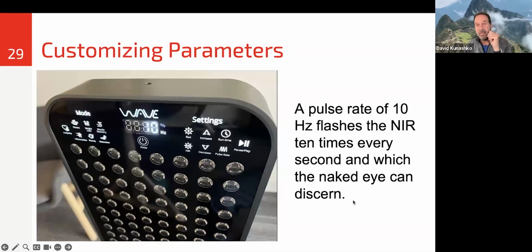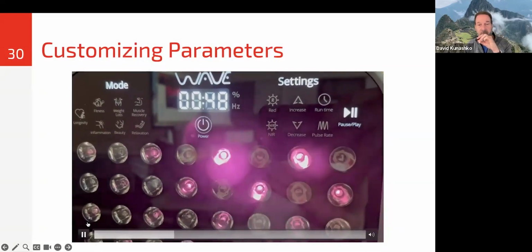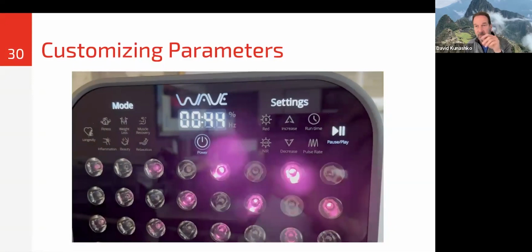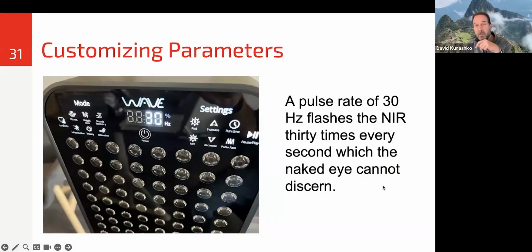Now, 10 cycles per second, or hertz. To the naked eye, you can still see this, but it's interesting as you start to increase the hertz, it starts to become invisible. This is 10 cycles per second. You can see it flickering, right? That's 10 pulses per second. You see the flickering? This is 30 hertz, 30 pulses per second.